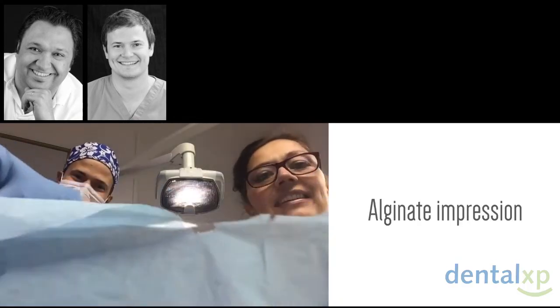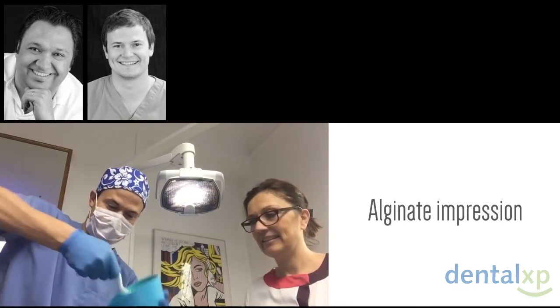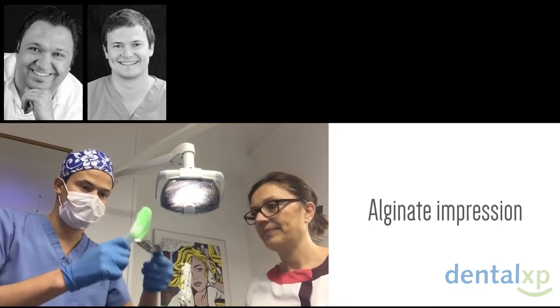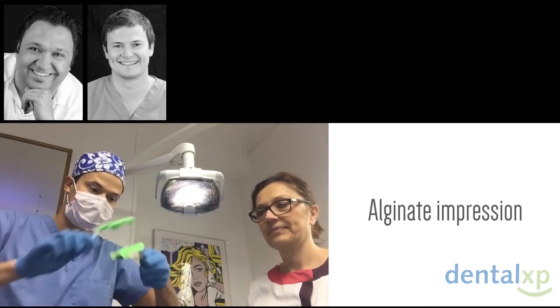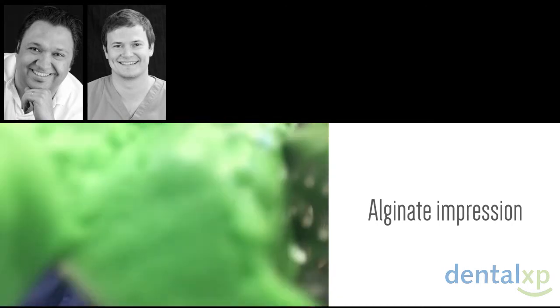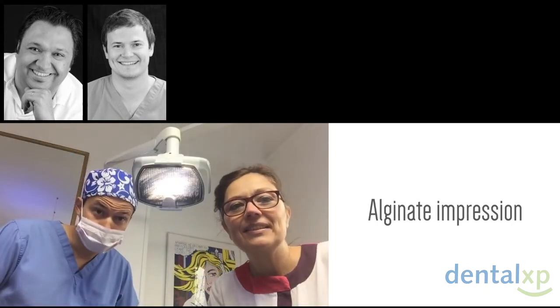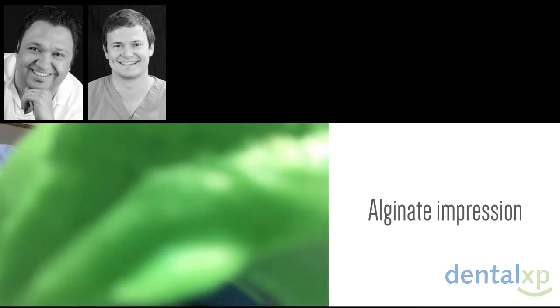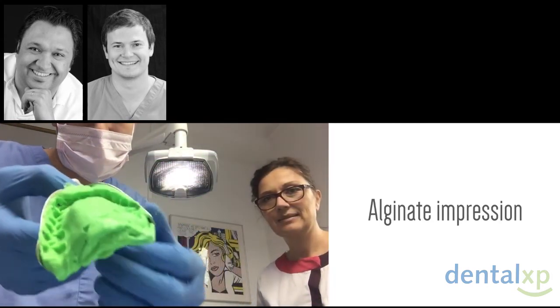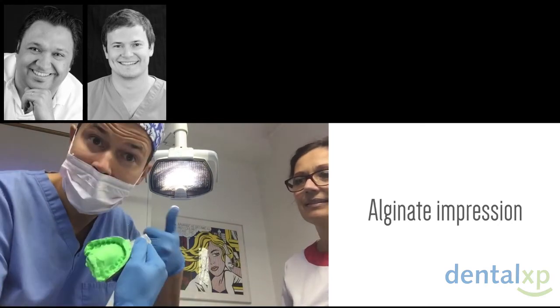Yes, and going fully digital should not be seen as a fancy trend to promote our activity or practice. It is something that is going to change the way we work and the way the patient feels. From their point of view, as you can see in the video, the first revolution is that we get rid of the alginate impression. It was seen by clinicians as an easy step, but it was rarely done on first consultation as it could be perceived as an invasive procedure by the patient.